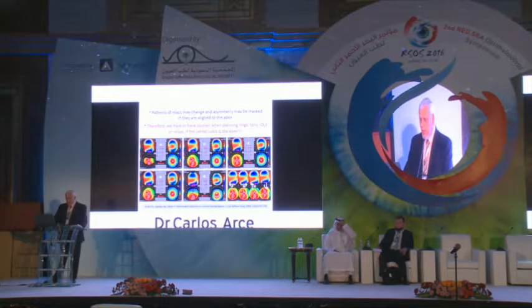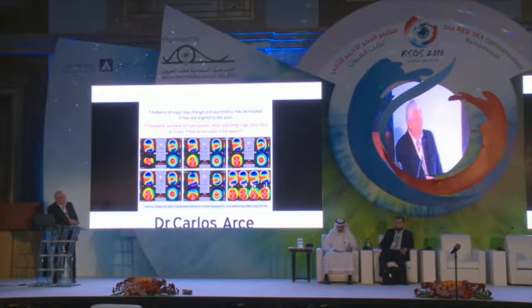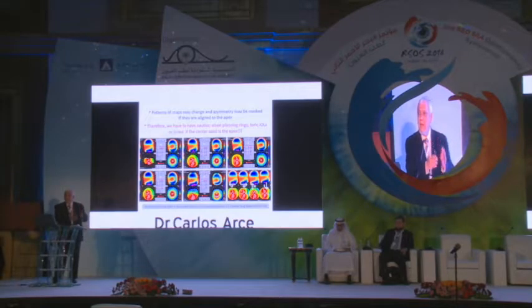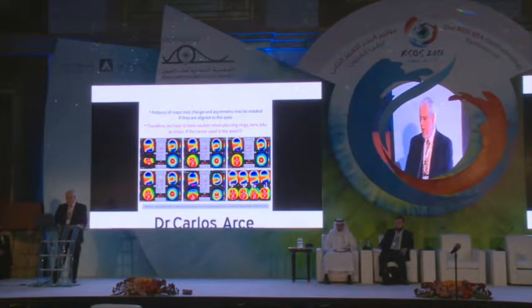And this is very important, as Dr. Sinjab showed, because the maps and the pattern of the maps will change according to where the data is centered. The astigmatism may be different if aligned to the apex, to the pupil, or to the first Purkinje. This is very important, for example, to plan toric IOLs. The pattern of the maps, all from the same patient, can be totally different. So if you plan intracorneal segments for this cornea, it will be totally different than for this one, but both are the same, only the data is aligned to different points in the cornea.